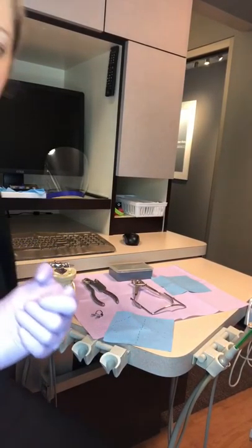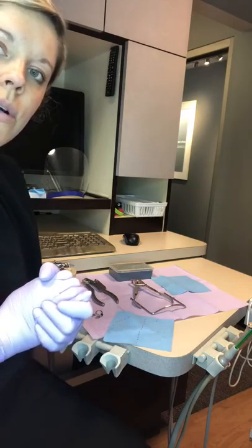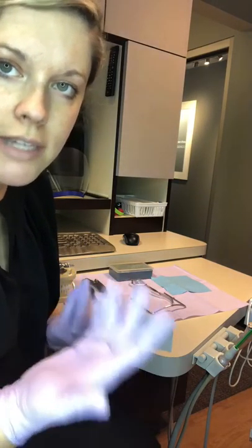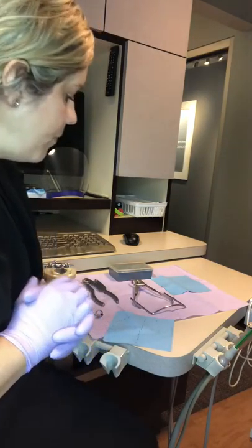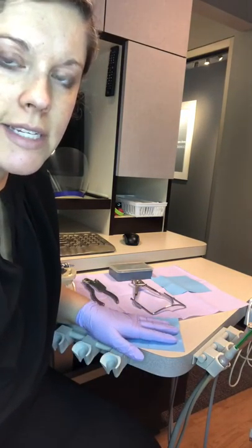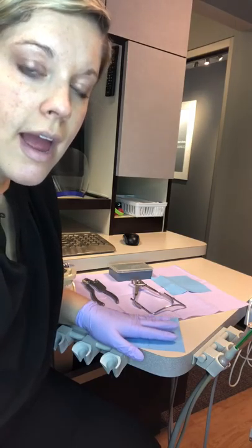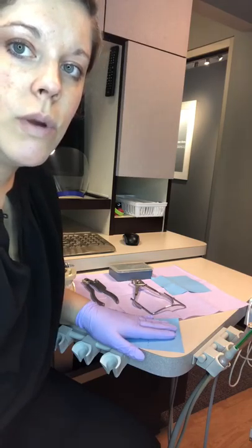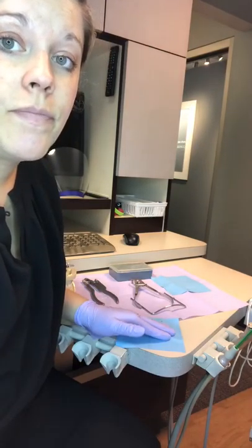What we're going to do today is teach how to assemble the rubber dam and place it on the teeth. In Ohio, dental assistants cannot place the rubber dam on the tooth; however, you want to be able to get it all set up for the dentist, and also understand the concept of it being placed on the tooth and how to set it up.